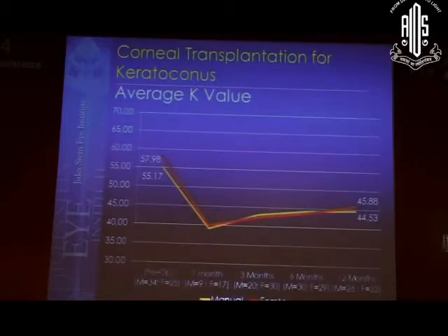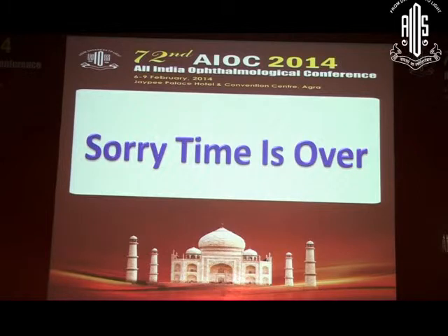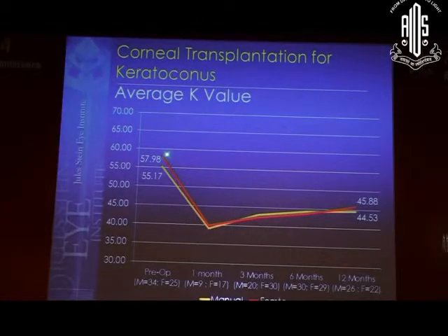But we're going to evaluate this. We need to compare it to manual keratoplasty. So to compare apples to apples, I looked at my patients with keratoconus and compared the femtokeratoplasty group, which is in red, to the manual keratoplasty group, which is in orange. And you'll see that preoperatively, the femtokeratoplasty group was starting off about 2.6 diopters steeper, and postoperatively about 1.3, 1.4 diopters steeper.